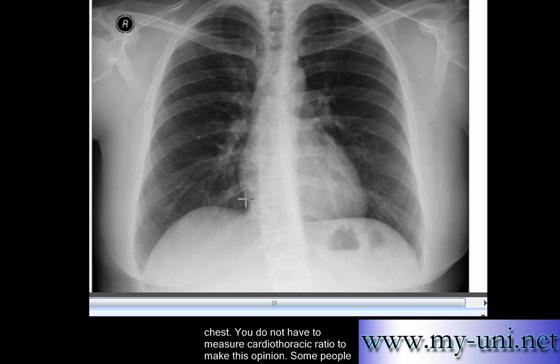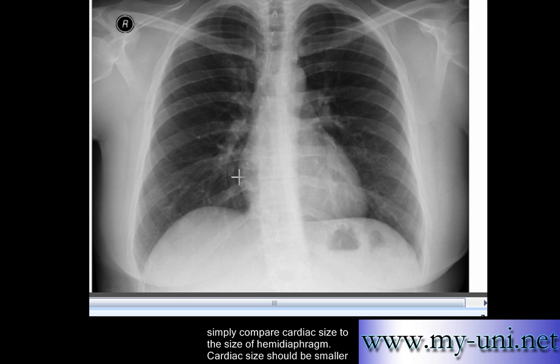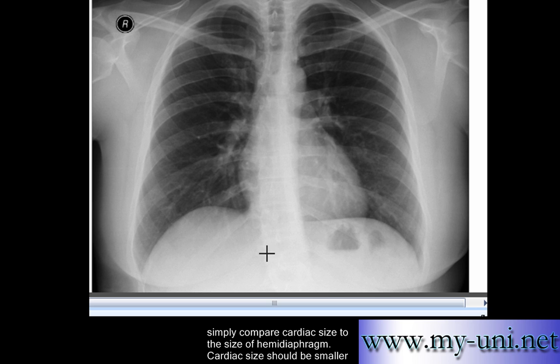Some people compare the cardiac size with the size of the hemidiaphragm. The cardiac shadow — the transverse diameter of the heart — should be less than or equal to the size of the hemidiaphragm.